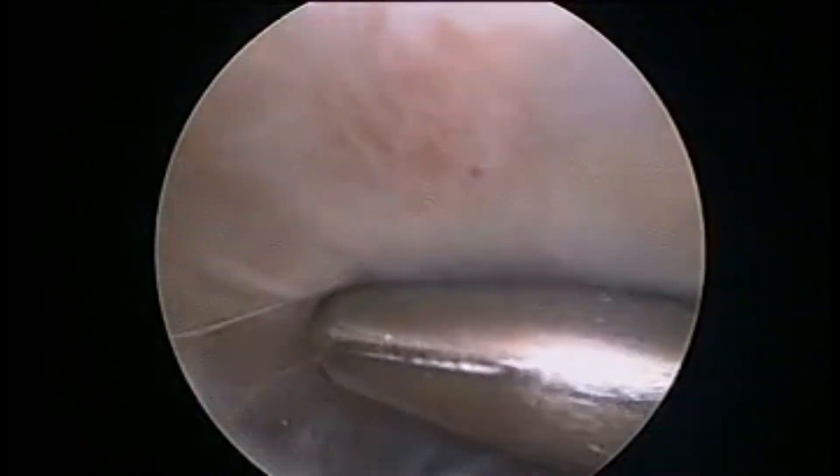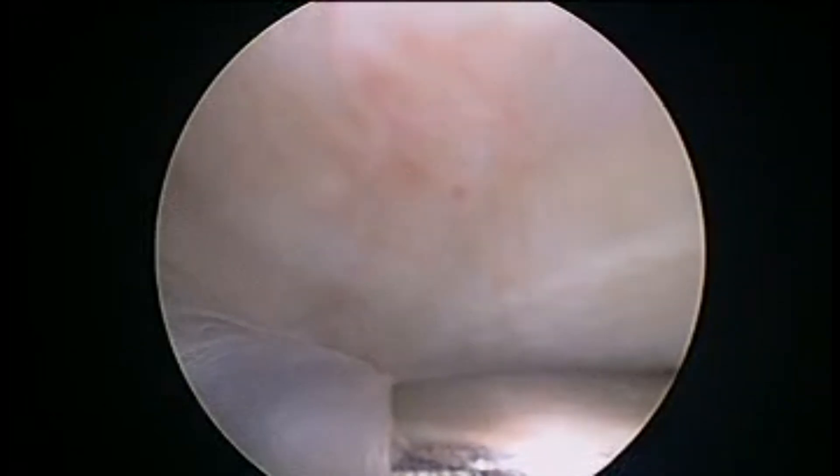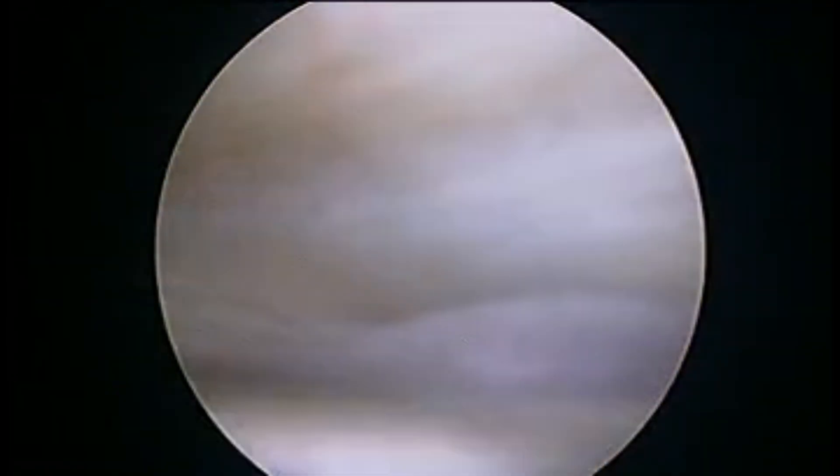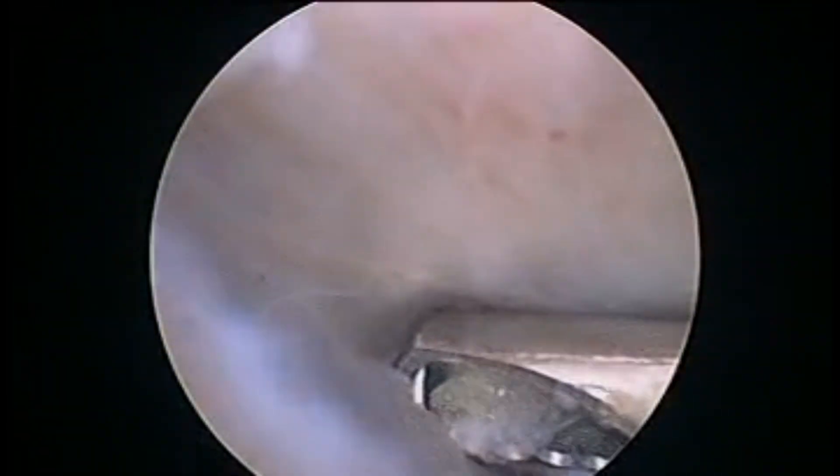We then exchange the 30-degree scope with a 70-degree scope to see inside the cyst and perform a cystoscopy. We further break the septae inside the cyst and shave the lining of the cyst so as to decrease the chances of recurrence.